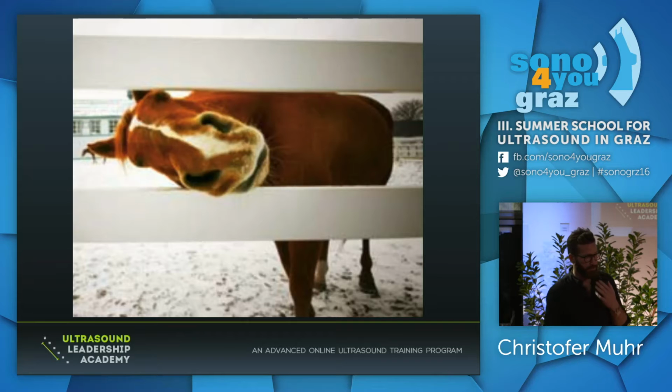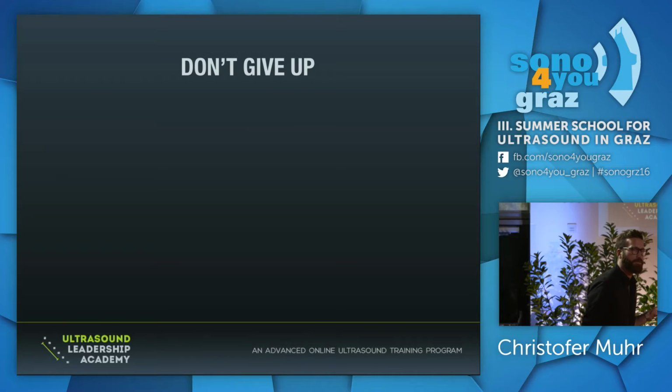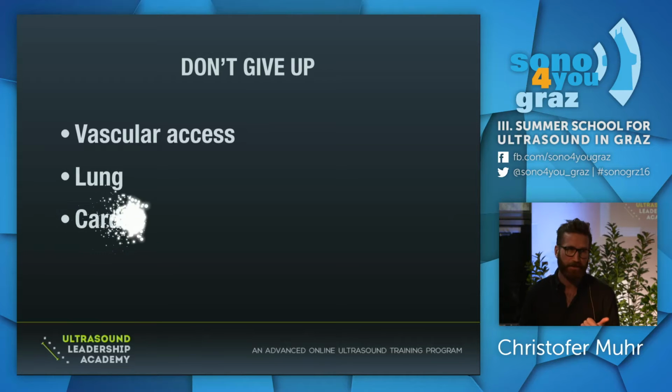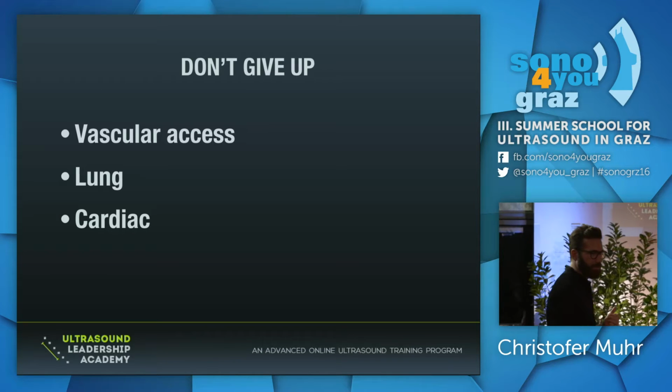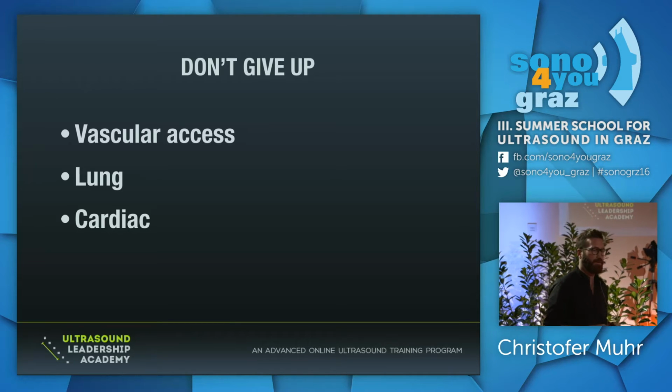Yeah, you've already seen this, but this is what we're struggling with, right? But so don't give up. And I think I'm just going to tell you, I have 3 favorite applications for ultrasound, and it's vascular access, lung, and cardiac. Of course, I'm biased since I work with internal medicine, but at least in my country and most of the European countries, gunshot wounds, stab wounds, or super big car crashes isn't as common as heart failure, COPD, sepsis, stuff like that. So I'm sorry, but you have to focus on the boring stuff now. So, okay, it's good. It's much more rewarding.